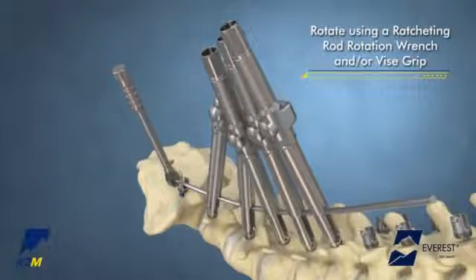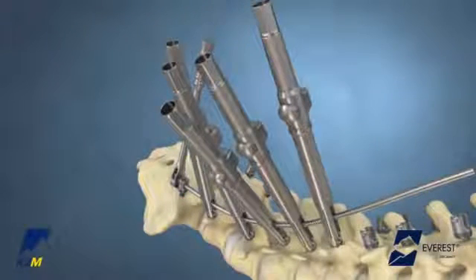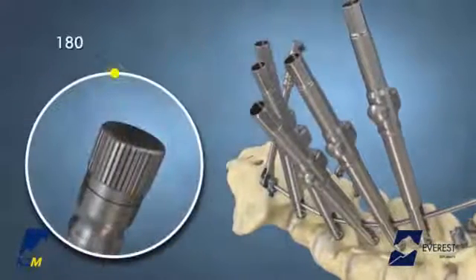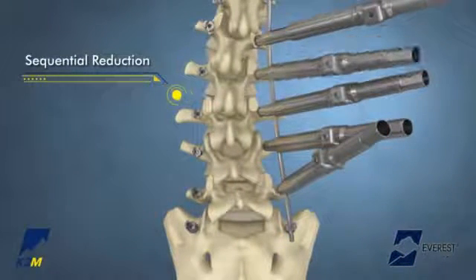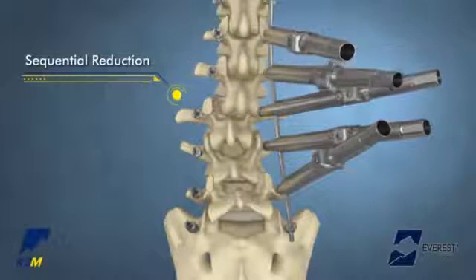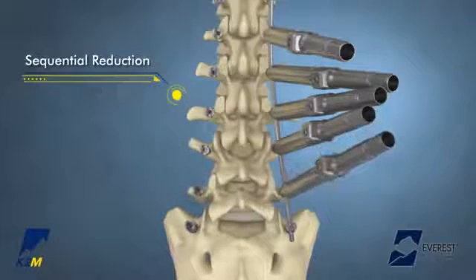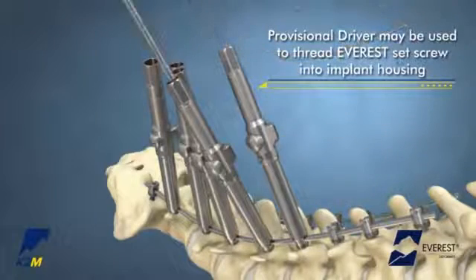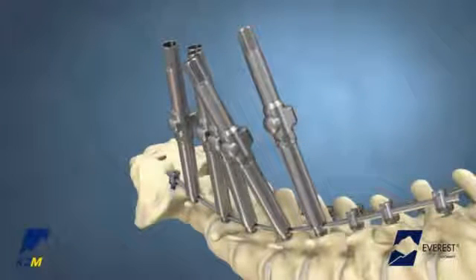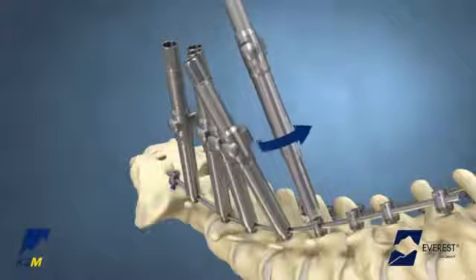Rod rotation is performed using the ratcheting rod rotation wrench and/or a vice grip. To reverse the direction of the ratchet on the rotation wrench, turn the proximal dial 180 degrees. Sequential reduction may be performed as previously stated. Once all Base Camp Tubes are maximally reduced, the rod will be captured in each of the screw heads. The Everest Set Screw may be passed through the center of the Base Camp Tube and threaded into the implant housing using the provisional driver to provisionally tighten the construct. To disengage the Base Camp Tube, press the release button and pull upward to release the reduction, then twist to disengage the instrument from the implant housing.